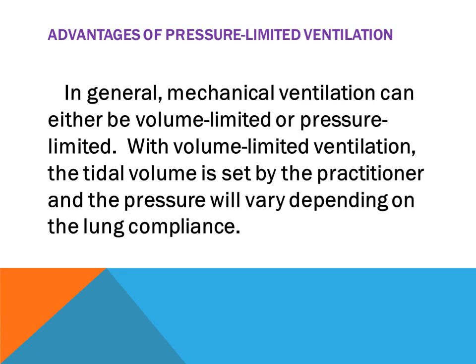Introduction. Non-invasive ventilation is described as BiPAP, and BiPAP is actually the trade name. As the name suggests, it provides differing airway pressure depending on inspiration and expiration. The inspiratory positive airway pressure, that is IPAP, is higher than the expiratory positive airway pressure, that is EPAP.